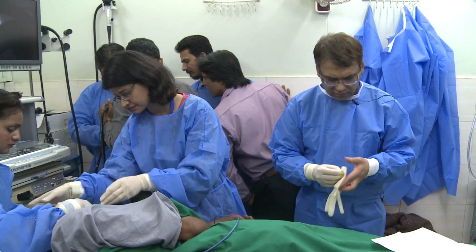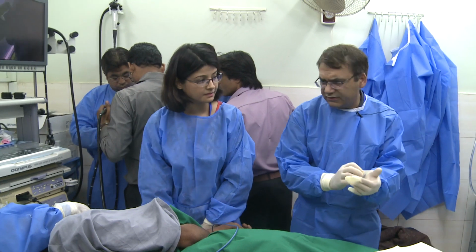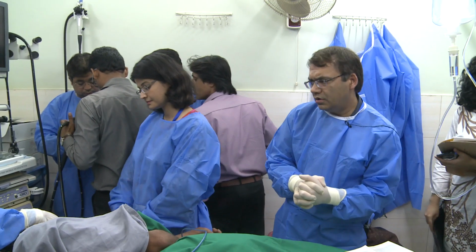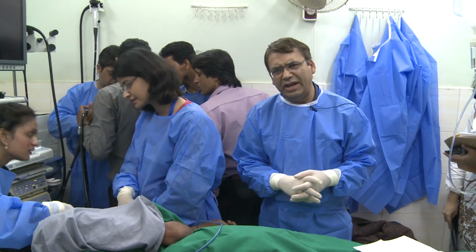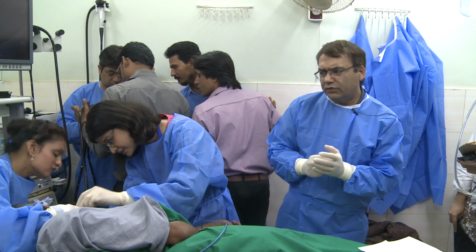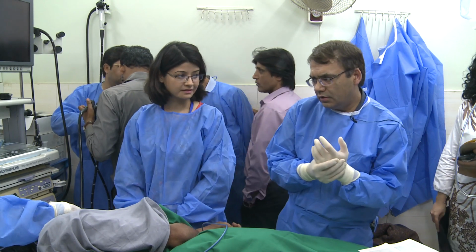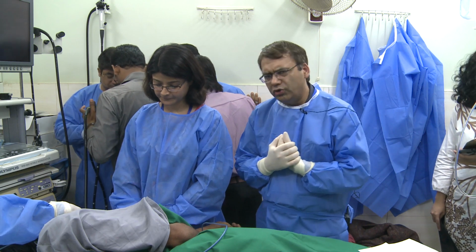What is your differential diagnosis in a patient like this? I did not honestly hear the whole history. The only thing is it's a mass in the neck of the pancreas, roughly about 4 centimeter, encasing the celiac artery, and then it's involving the portal vein as well. There was some filling defect in the portal vein too. So PVT with the cavernous transformation. So in all probability, adenocarcinoma.